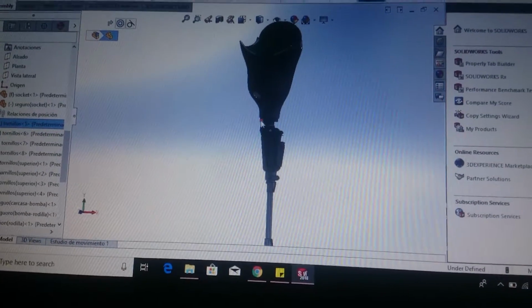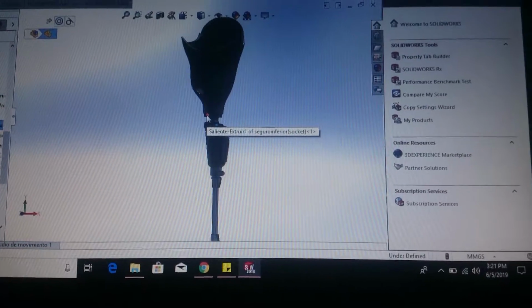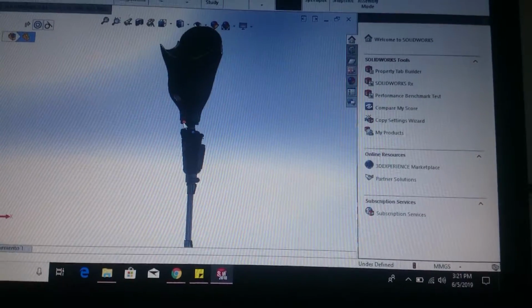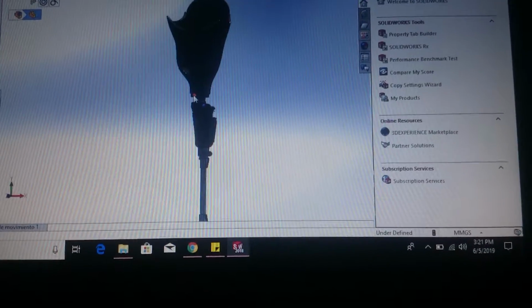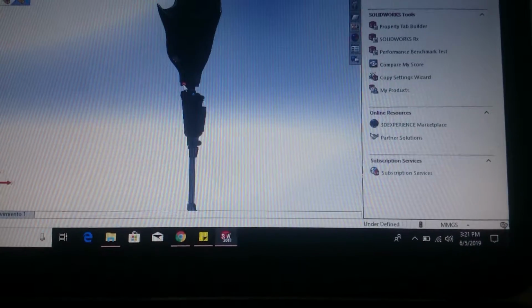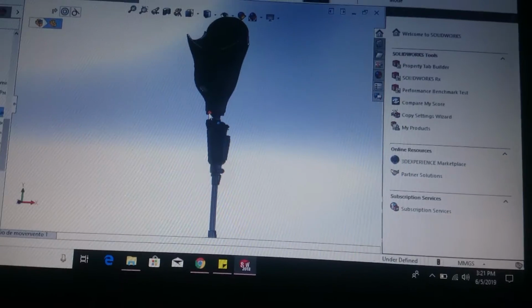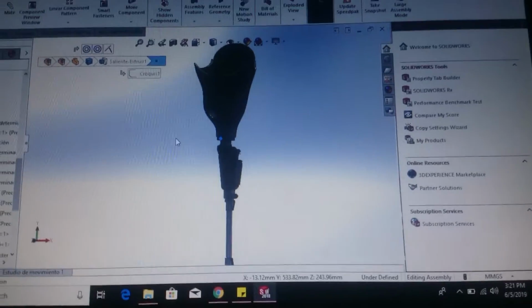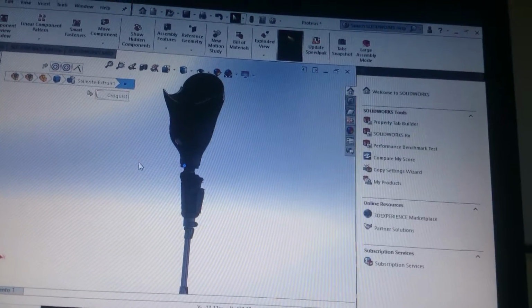The objective of this prosthesis: the lack of a leg is a situation of the most disability, since the person cannot do basic tasks such as walking or moving independently. The leg prosthesis allows the person to recover their independence as well as performance, from the most basic tasks such as stand and walk, even the most complex such as run and go up and down stairs.